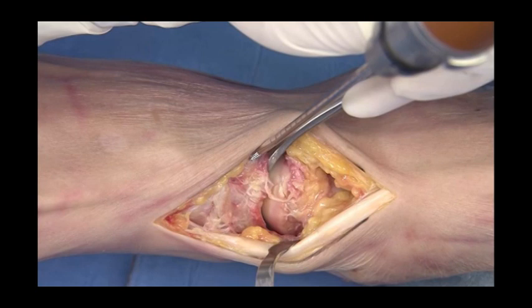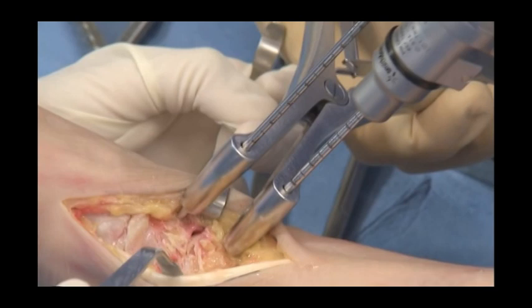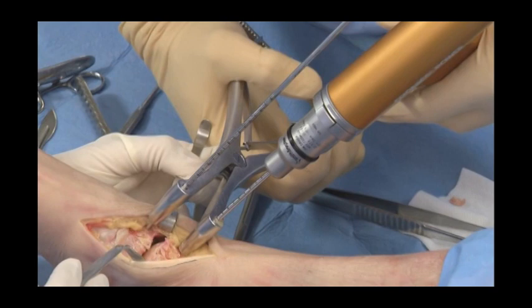Threaded 3.2mm joysticks are positioned on the lateral part of the wound to help distract, position, and compress the joint along the procedure. The distractor is used first to expose the joint.